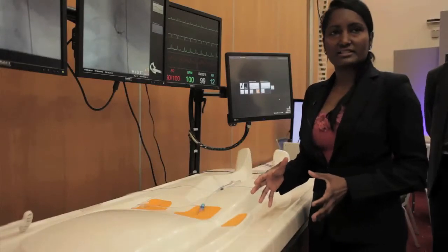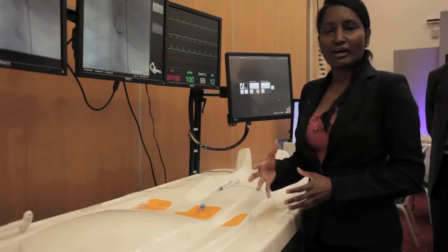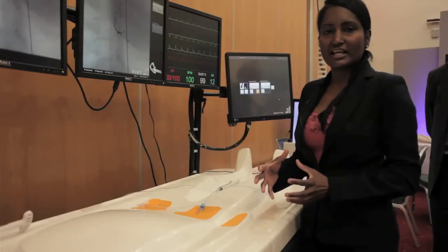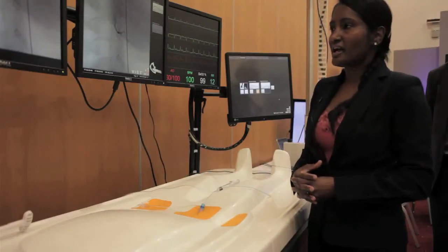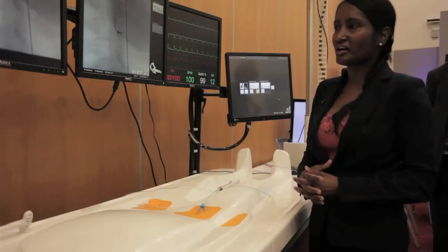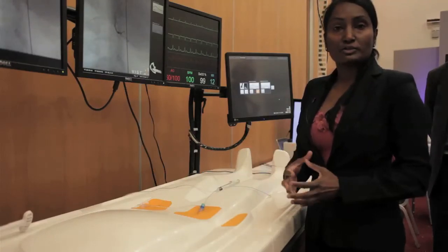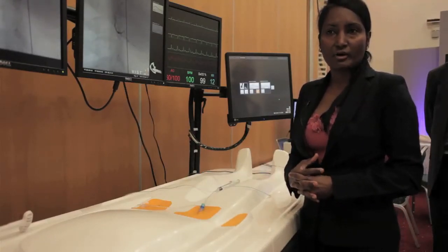That essentially is performing left heart catheterization of the right coronary artery and the left coronary artery. Keeping the technique safe is a key in every procedure that one does. Plenty of practice with simulators and in real life enables one to perform cardiac catheterization in a safe way for our patients.